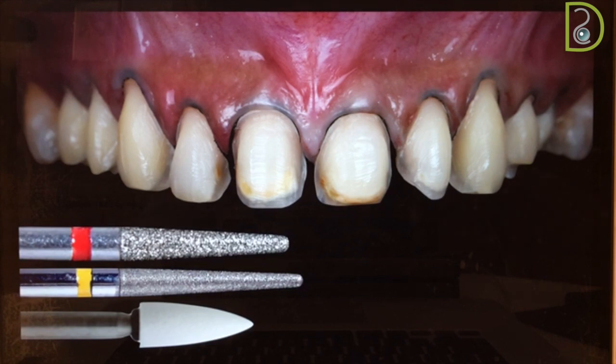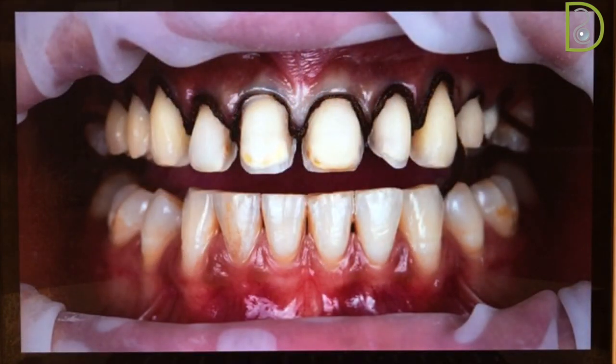Second cord, I like it to be continuous, just going to be easier for you to remove it. Now also, to prevent areas of stress concentration, we need to make sure that all prepared surfaces are rounded, then polish the preparation with the white stone or soft lex discs. Again, the retraction cord you see over here is the second retraction cord, and as I mentioned, it makes me happy to keep it continuous. It's going to be easier for me to remove it later on.